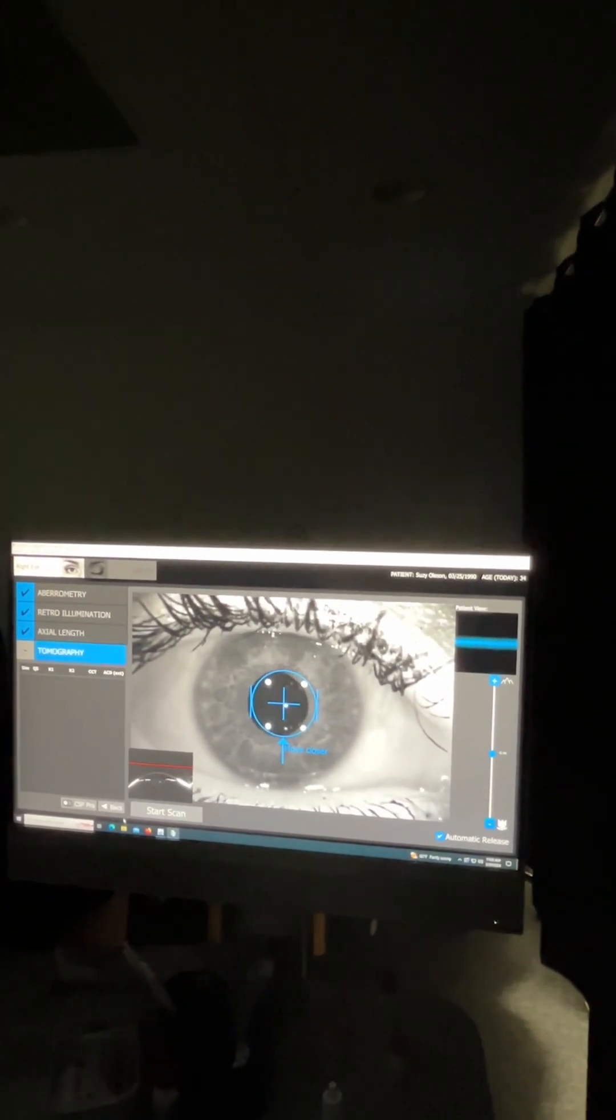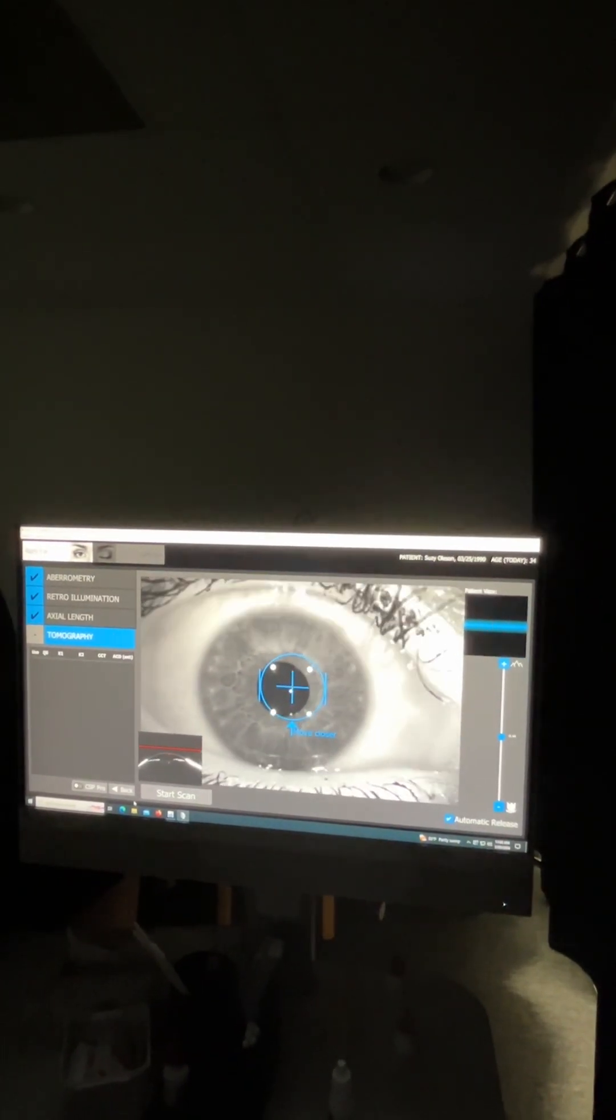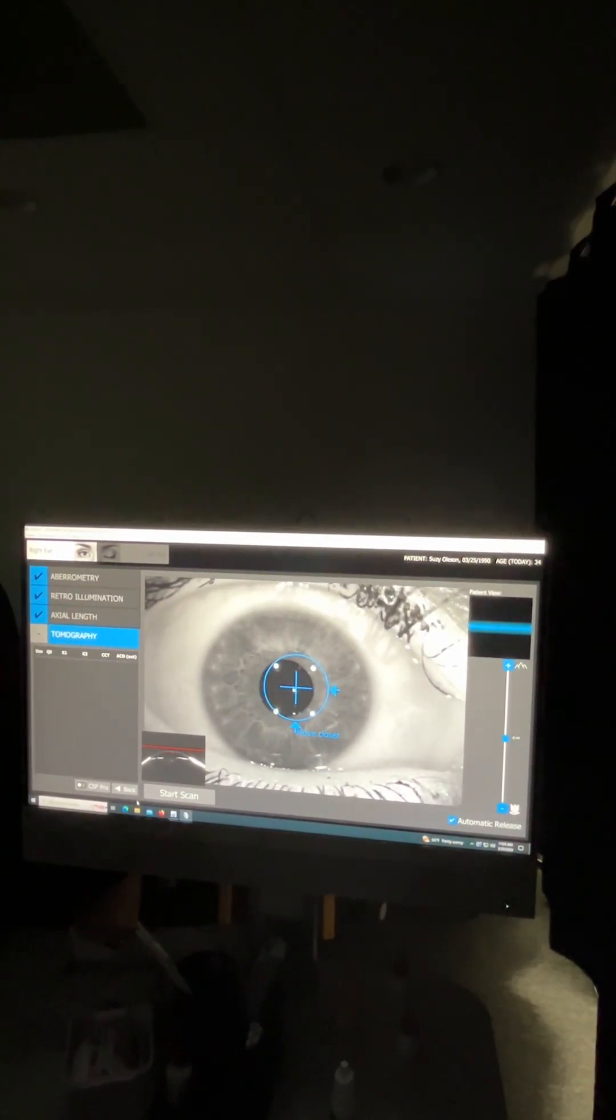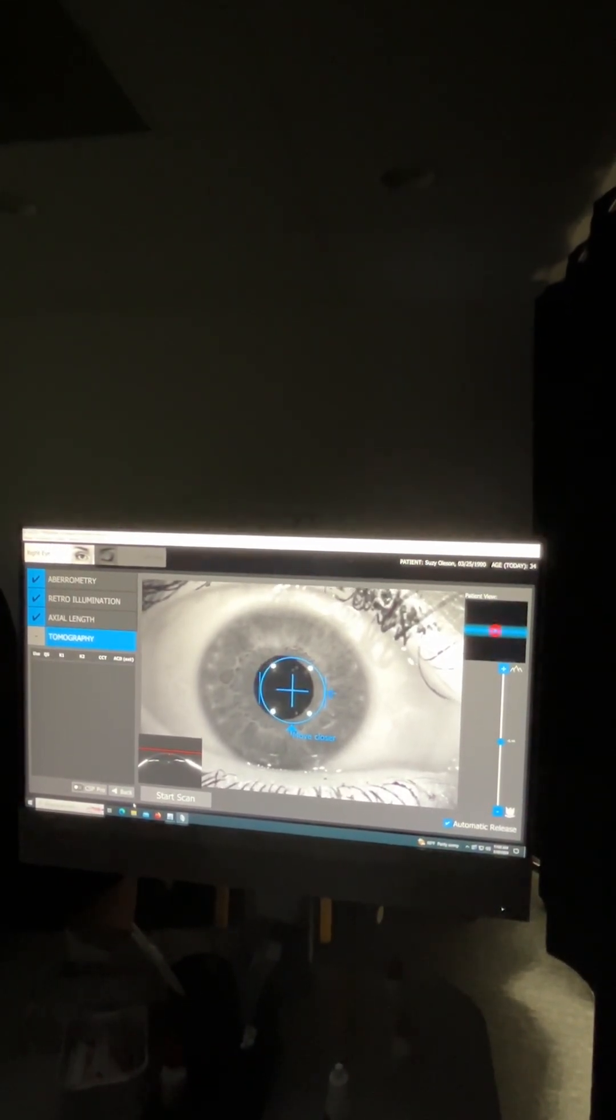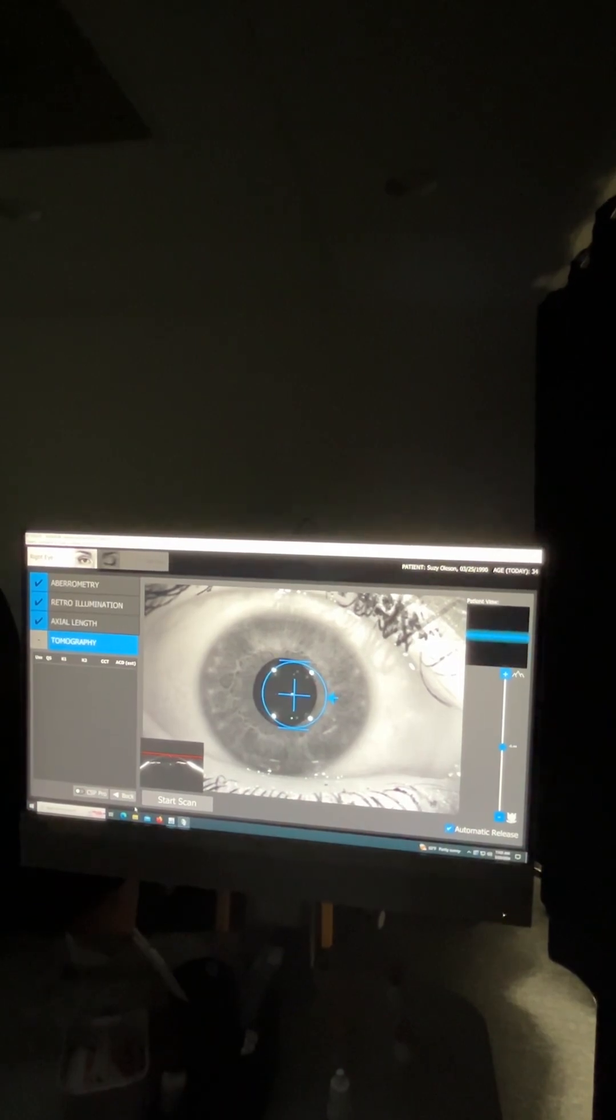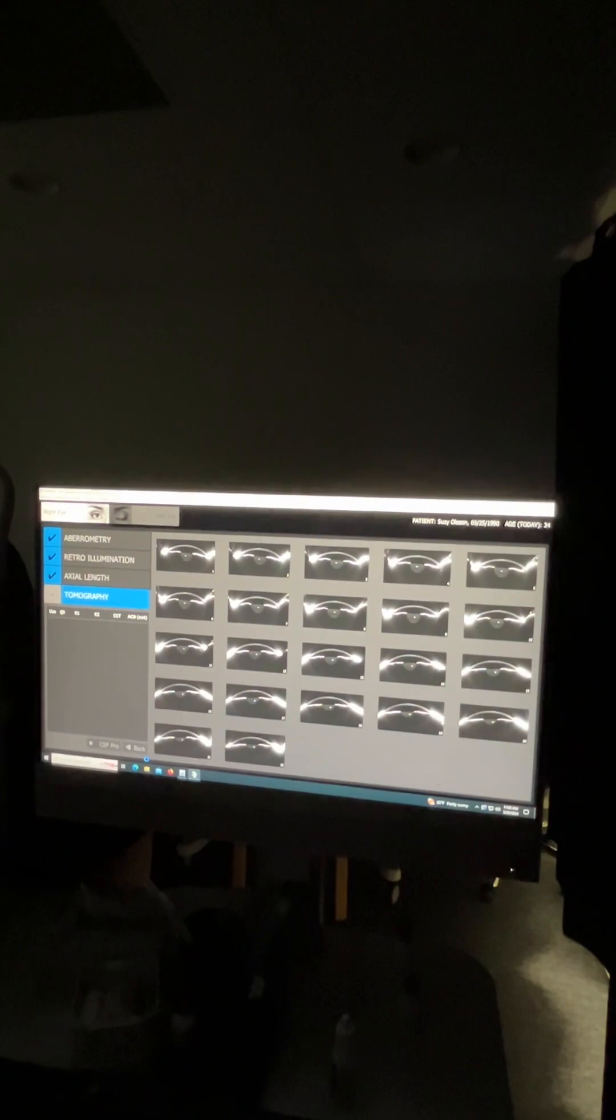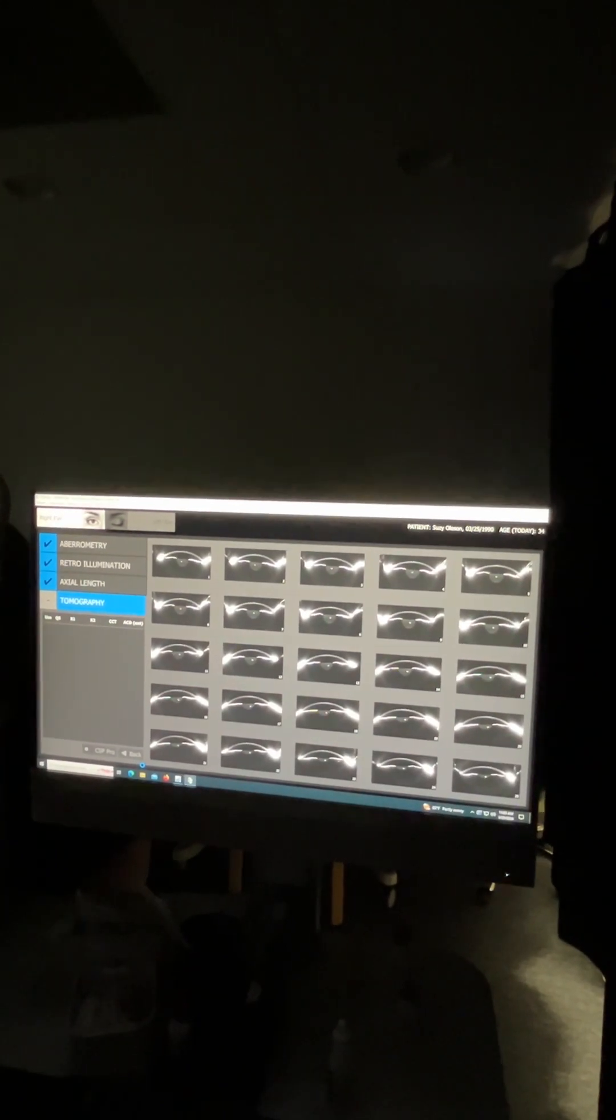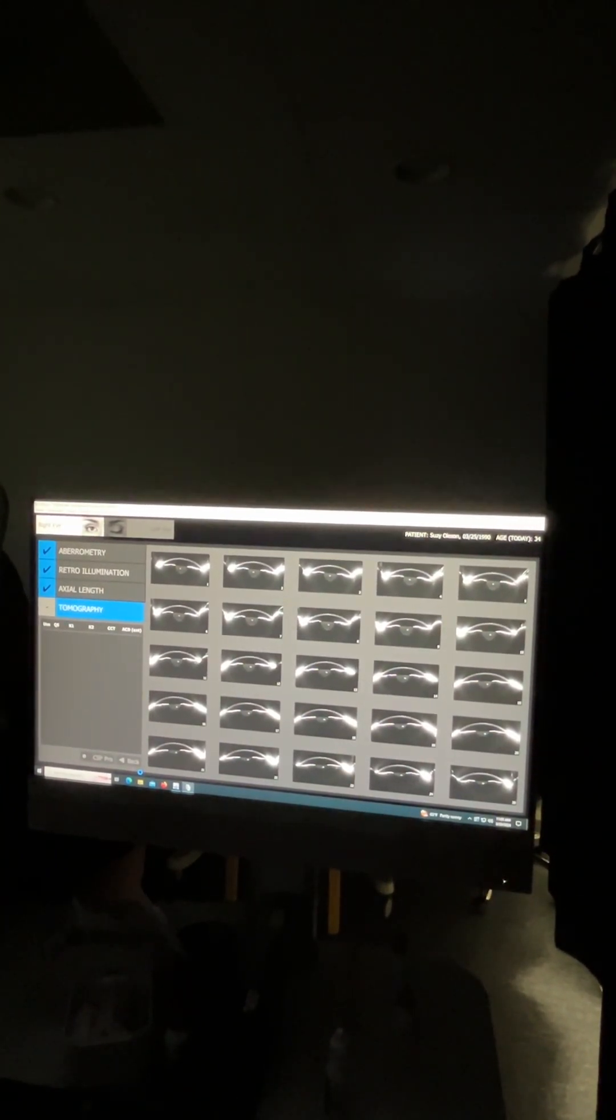You instruct the patient to blink a couple of times and then open their eyes wide and then tell them to hold their eye open until they see that that blue bar has stopped rotating. So Susie, we're going to go and do that. You can blink a couple of times, open them wide. And then once it starts to rotate, keep your eyes open wide until it stops rotating. Okay, good.